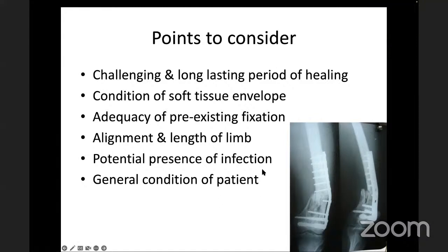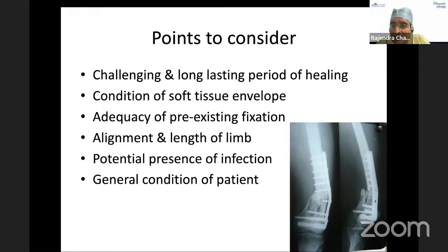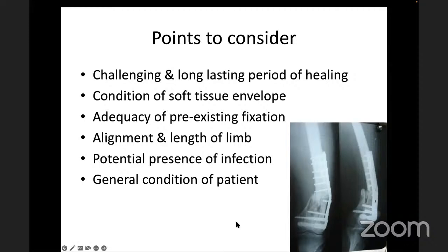Yes, Doctor, please go ahead. This situation which occurs here is because of doing an open surgery. Suppose this surgery would have been done with a long plate and with a MIPO technique bypassing the fracture zone, it would have given a better result than this. This is, I think, an open reduction and fixation by plate. Yes. And probably the post-operative X-ray must be very excellent, but the vascular problem as well as the mechanical problem has contributed to this type of effect.